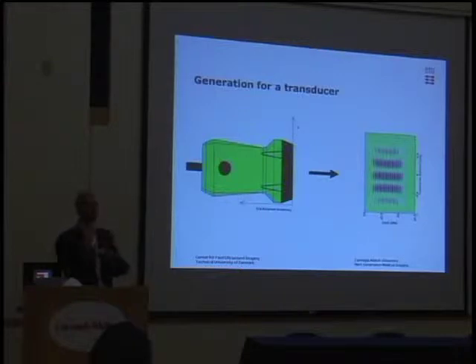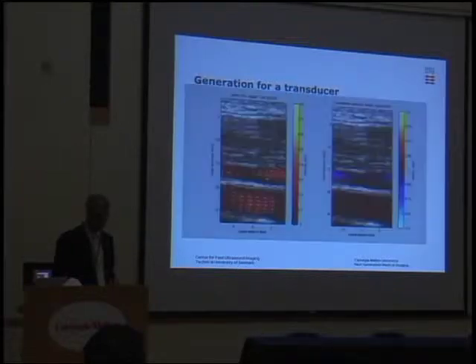What we essentially do when we implement this in the scanner is that we send out a normal ultrasound field, and then we create everything in receive. So we have 2 receiving apertures. It's a detail, but we can generate fields like this. This is what you can see.